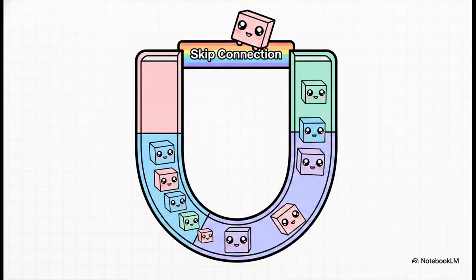And this brilliantly illustrates how they achieve that semantic segmentation. The engine utilizes a custom implementation of a UNet architecture. Now, UNet is pretty famous in medical imaging for its U-shape. It features an encoder that compresses the image to figure out the what, and a decoder that expands it back up to figure out the where.